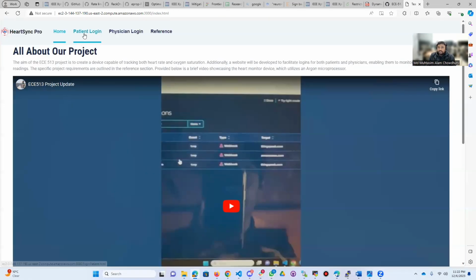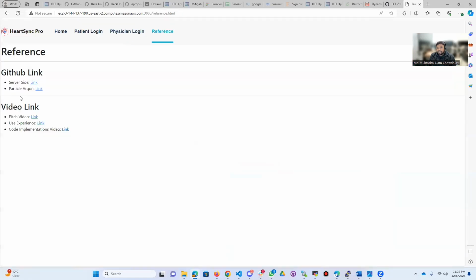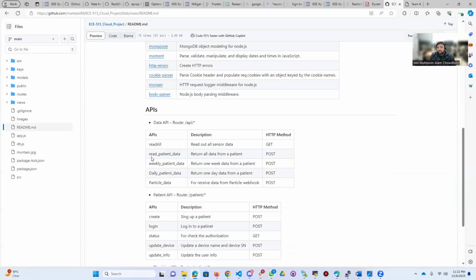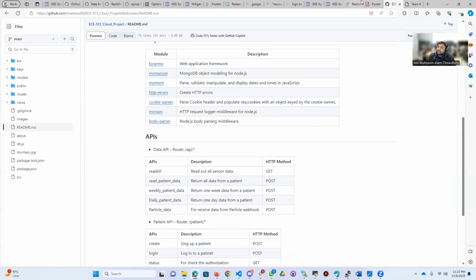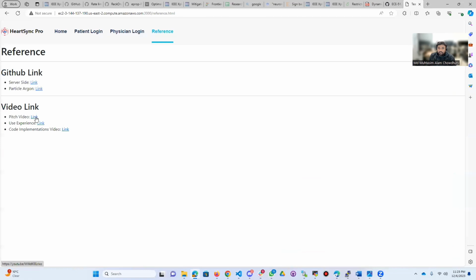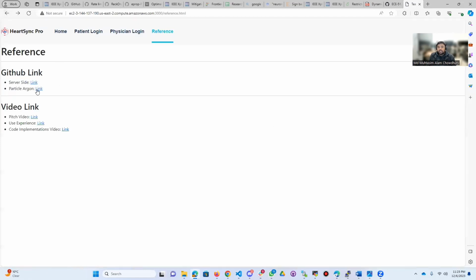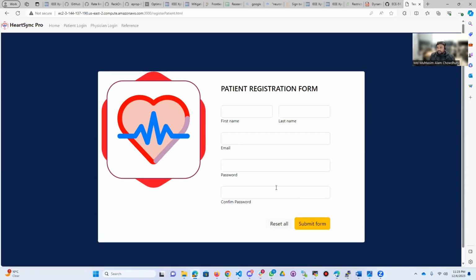Here you can see a patient login page, a physician login page, and a reference page where you can see the video link and the GitHub link. I have opened it here. You can see the GitHub link where all of the libraries and everything is. You can go and check it out. Then there is the server link and the Particle Argon link. Moving to the patient login, first we can register.